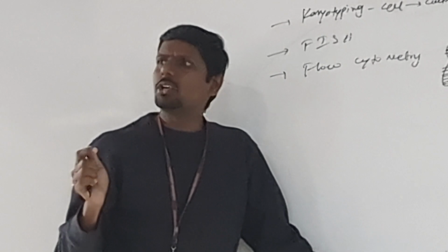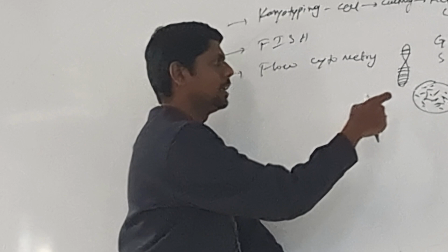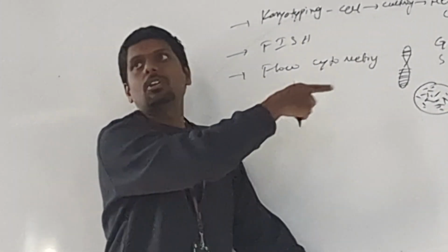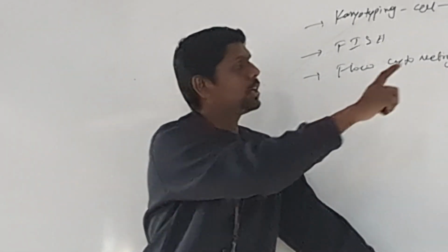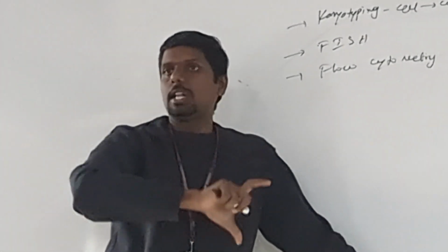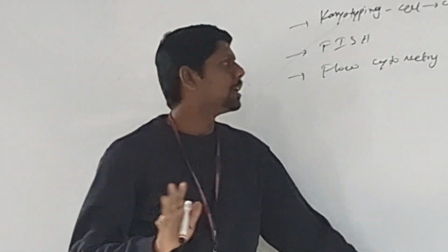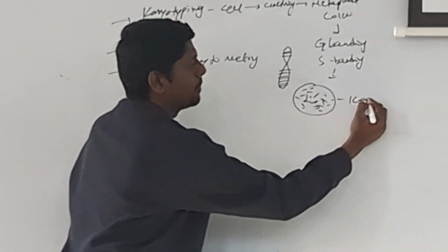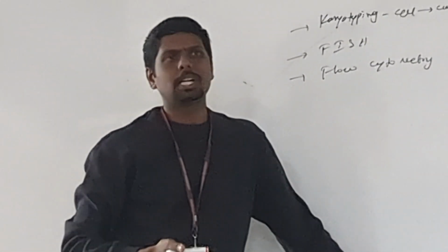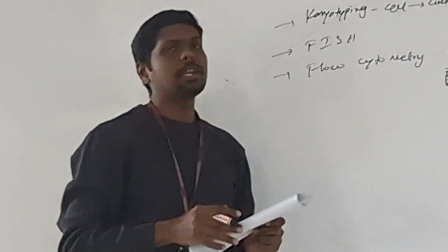Now there is a technique called the karyogram, simple. We are taking a photo of the chromosomes. Now the software will automatically arrange the chromosomes. After taking the photos, they will be stitched together into a collage. 23 pairs of chromosomes will be collaged. That concept is called a karyogram. Then we will get the chromosomes, 23 pairs. So this is the typical workflow of karyotyping.